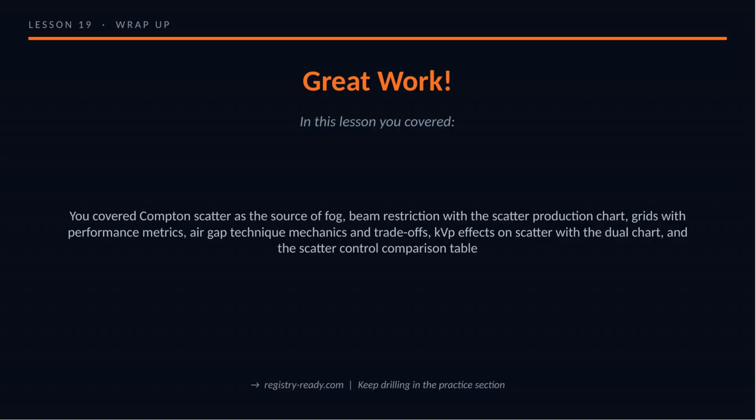Scatter control is not optional. It is the primary technique tool for maintaining contrast in thick anatomy. Collimate on every exam. Every centimeter counts.